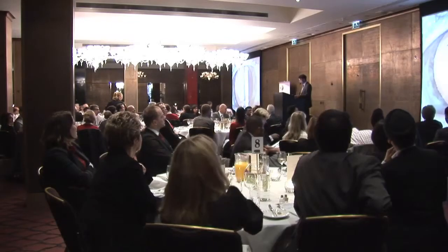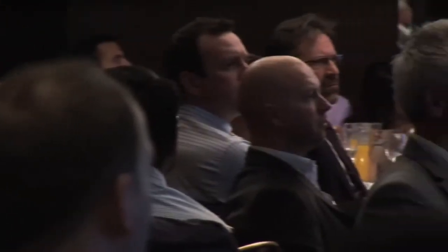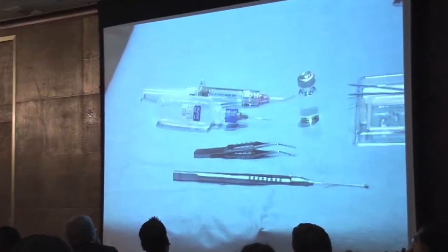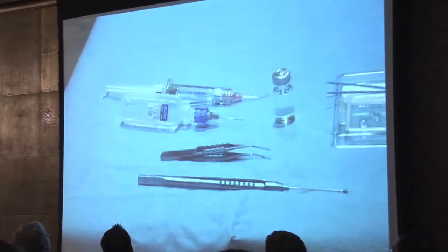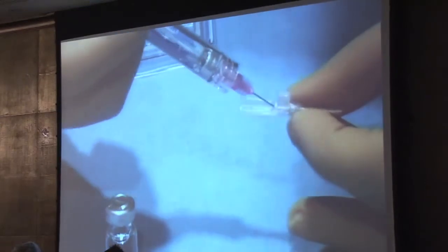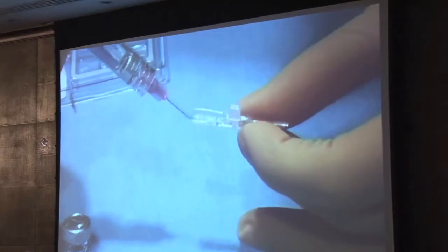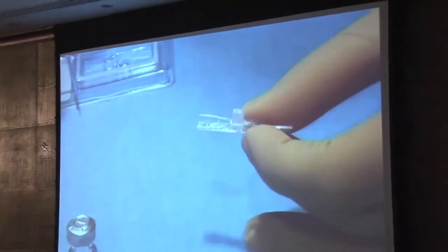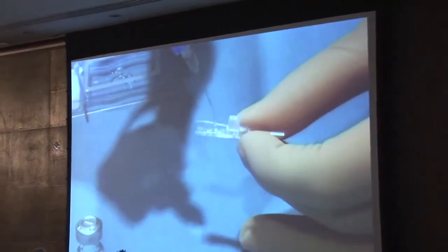Now, I brought you a little video, and this is a video with a surgeon from Belgium, Dr. Eric Mertens. You see the preparation. For toric ICL surgery, only a few instruments are needed. The first step is to fill the cartridge with methylcellulose, and that's a cartridge which we provide. Overfill the open end of the cartridge. This space is filled with a few drops of BSS.